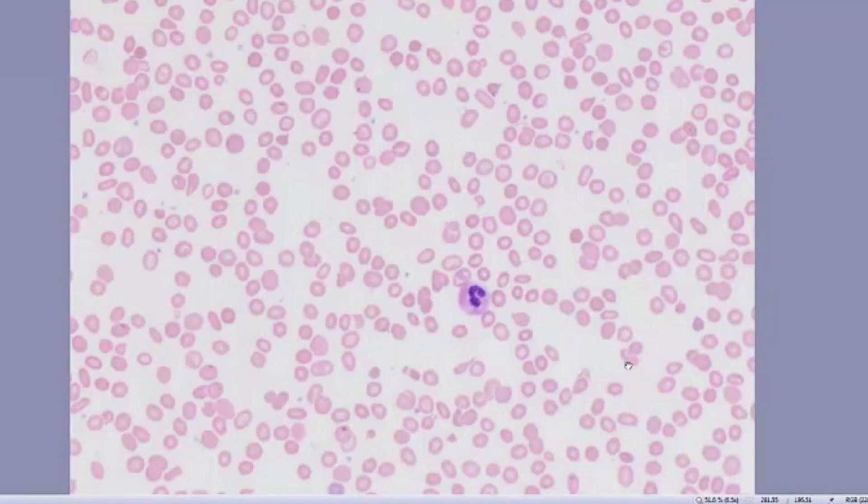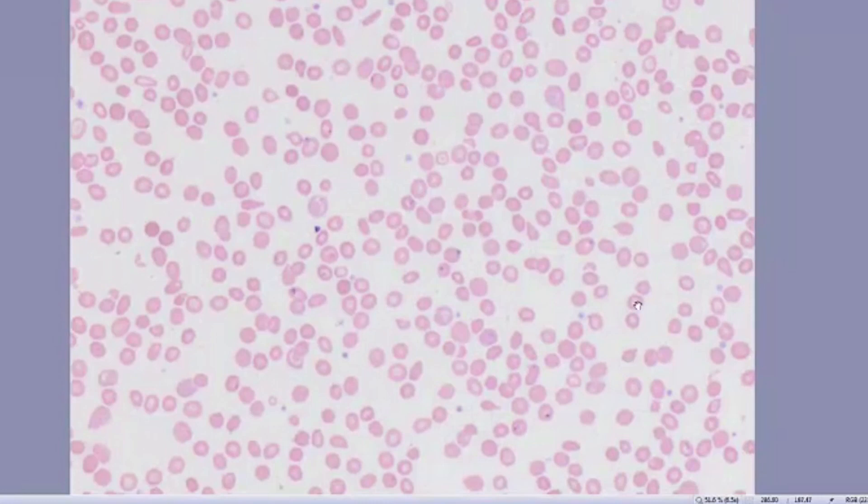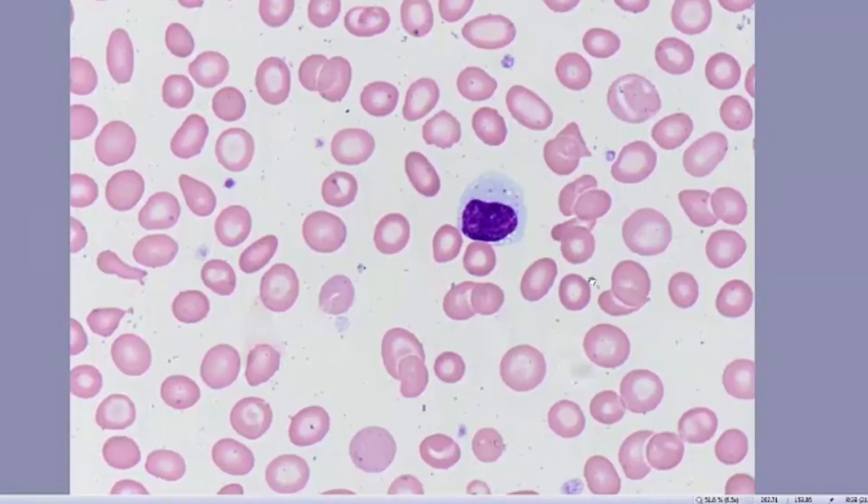This neutrophil appears to have normal granulation. And looking around in other fields, you can see teardrop forms, elliptocytes, and target cells. Platelets appear to be normal in number. Under oil, we can further see the red cell abnormal morphology.